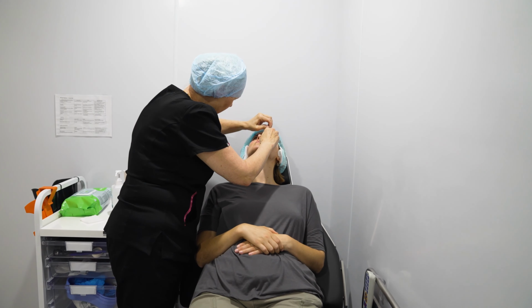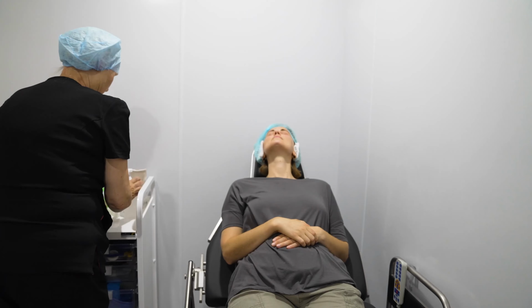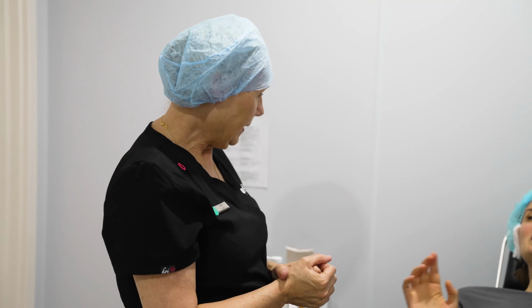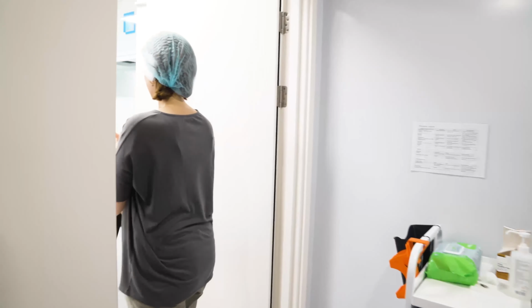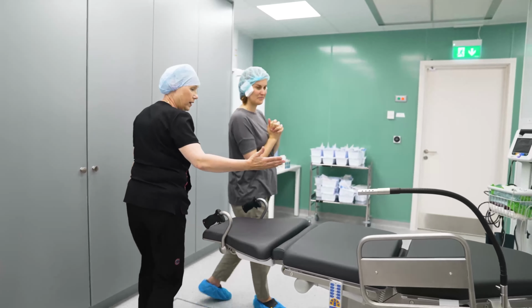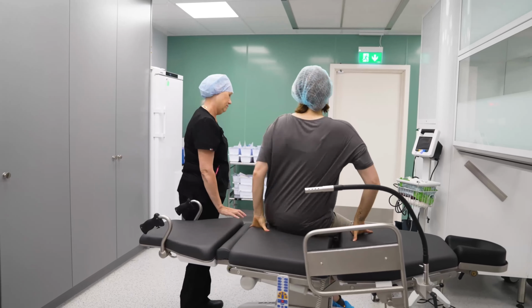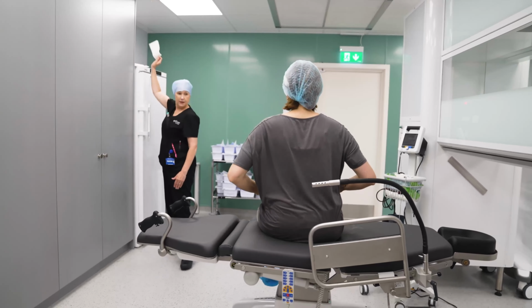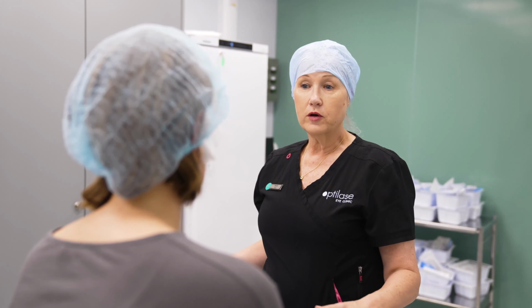And usually that involves being under a microscope, and you will see a bright light while you're under the microscope. We operate on one eye at a time. So one eye, we have a drape covering you, but you are still able to breathe. The drape is held above. We have a bar that holds the drape up, and we will put a speculum into one of the eyes, and that is the eye that we are going to operate on. The other eye, we ask you just to keep the eye open, just so that it balances the eyes up.